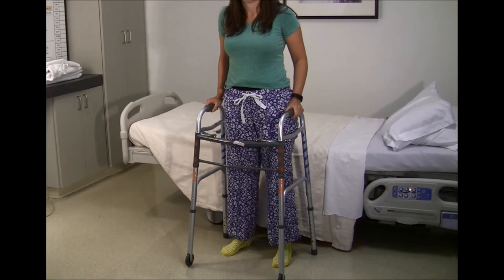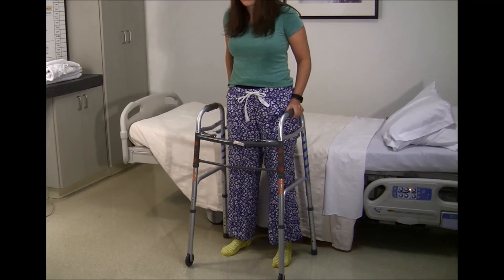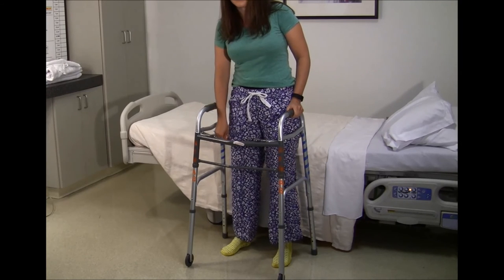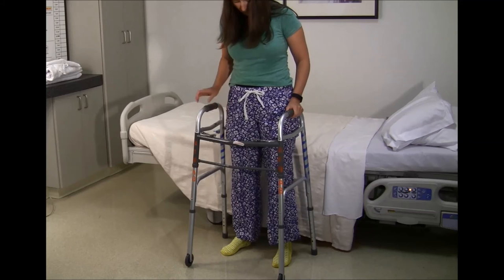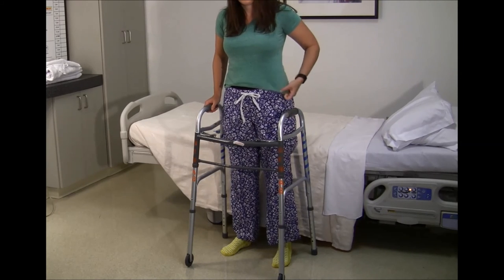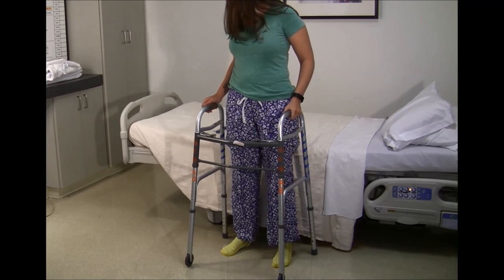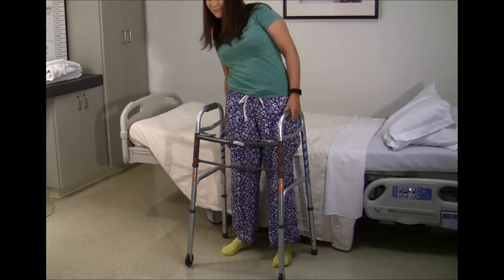It is important to remember that reachers are not meant to pick up heavy objects. From feedback gathered from previous patients, we have learned it is often helpful to have multiple reachers in your home — one upstairs and one downstairs, one in each bathroom for example. Previous patients have also reported hooking their reachers to their walkers or to an apron to be carried from point A to point B.